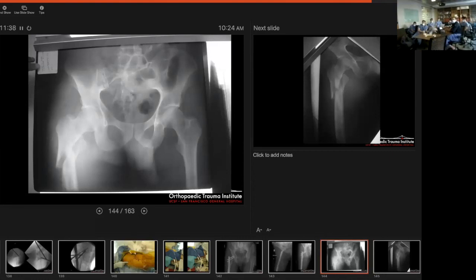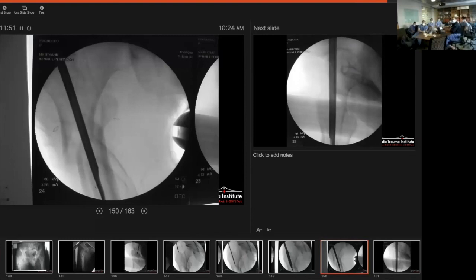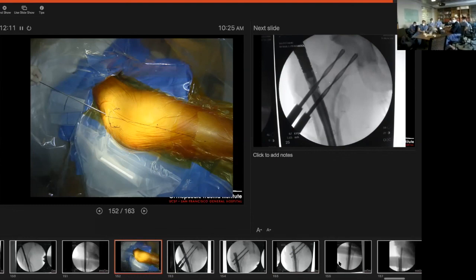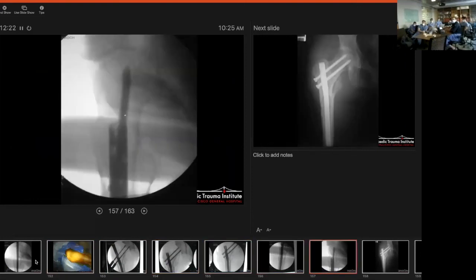Another subtrochanteric fracture case: trochanteric start, guide rod goes in, reamer goes in. There's a little bit of varus visible on AP, lateral view looks okay. We use the intramedullary reduction tool — we call it the finger — in order to get from the proximal to the distal fragment. We're going to fix that intraoperatively. Basically in this case we used the cob to push down on that fragment.